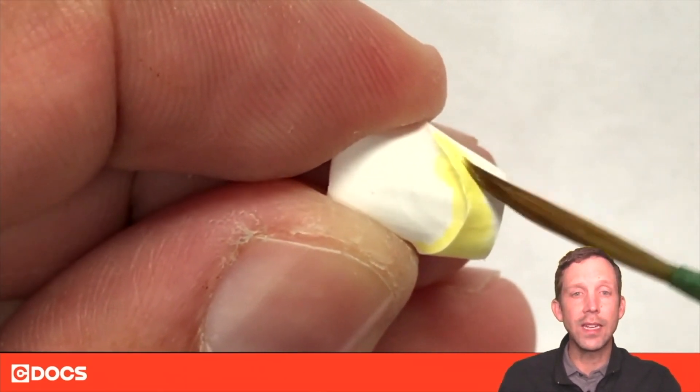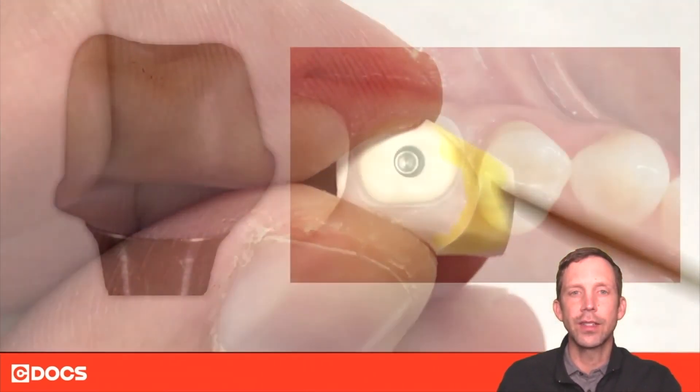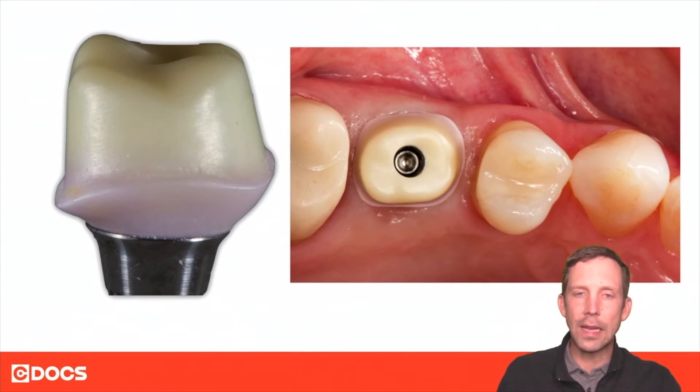There are many different infiltration liquids you can use, and if you want to have fun with it you certainly can. Here's an example of me playing around in the posterior with a base shade of A2, but also adding some pink just to see what's possible. Obviously on a posterior molar pink isn't super important, but it was a good opportunity to try it out. You can imagine that if you run into a super thin biotype and you're worried about the zirconia bleeding through the tissue, this might be an option.